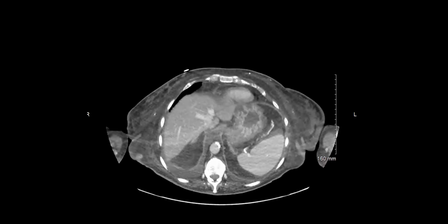And they're usually at the trigone or posterior bladder wall, like this case is, but it can also be anywhere. And they can be papillary or sessile or ulcerating. I didn't know, but there are several subtypes of primary bladder adenocarcinoma. This is primary bladder adenocarcinoma that had enteric histology, but there's also signet ring and mucinous variants as well.